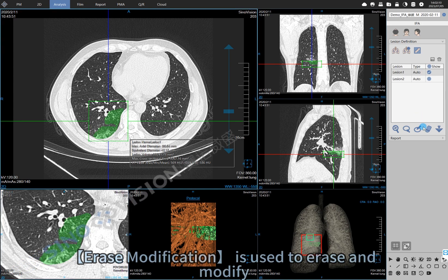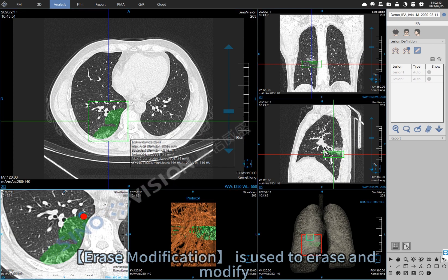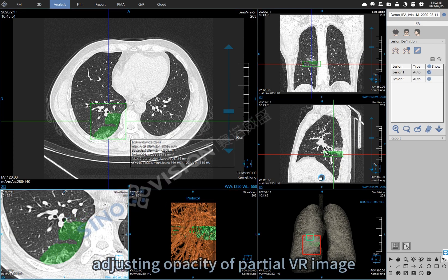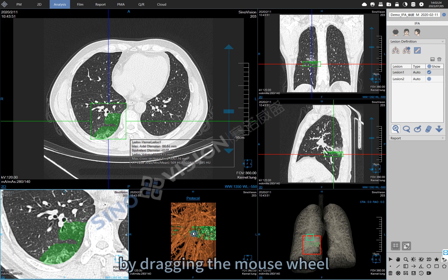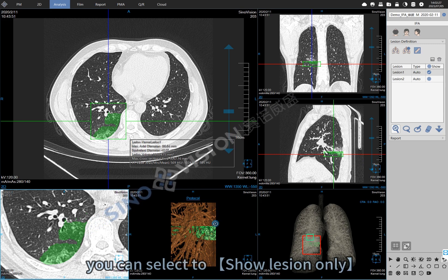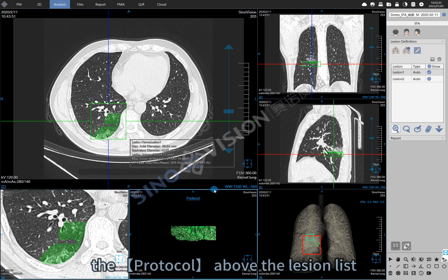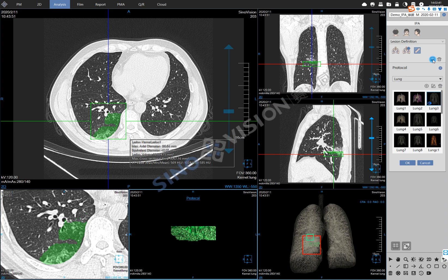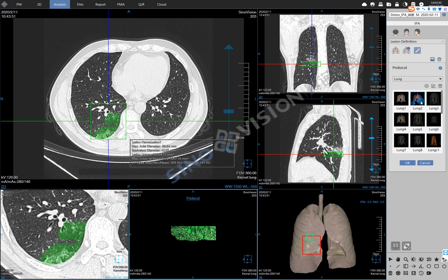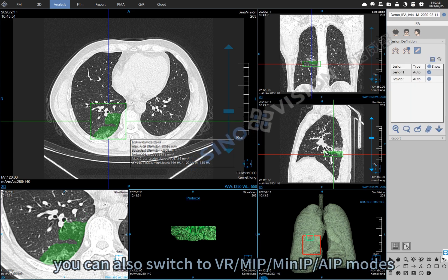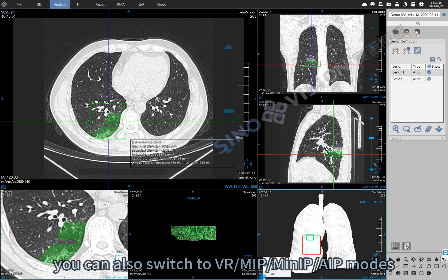The Erase modification tool is used to erase and modify. You can adjust the opacity of the partial VR image by dragging the mouse wheel. You can select to show lesion only or show the whole VOI area using the protocol above the lesion list. You can also adjust the whole VR image of lungs, or switch to VR, MIP, MINIP, or AIP modes.